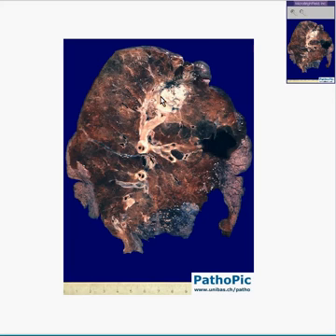Here's something which is touted as a peripheral tumor, but in all honesty, you could say it looks like it's about halfway. It doesn't look too close to these large bronchi, but it's not exactly kissing the pleura either. So let's call this a little bit more peripheral. The reason why I am is because I'm being very prejudiced, and I already know what it is. Let's take a look at it microscopically.